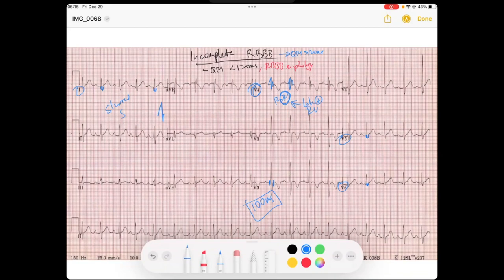In similar fashion, it's showing a little bit of evidence of late forces going away from the lateral leads, because that's a negative deflection. And that is something we see when you have some type of right bundle branch block morphology. So incomplete right bundle branch block — the main difference from a complete right bundle branch block is it'll be a narrow QRS, but it'll still have the similar morphology. It hasn't completely blocked to the point where it prolongs the QRS, which is when we say the threshold has been met for a complete block. I hope this helps — if you have any questions, throw them in the comments. Thanks.